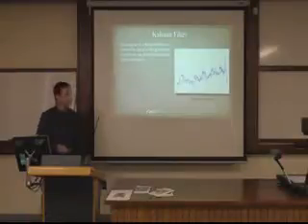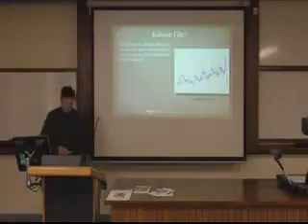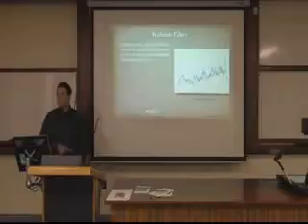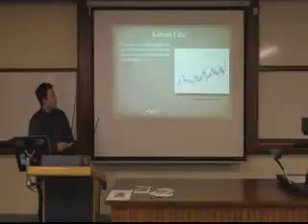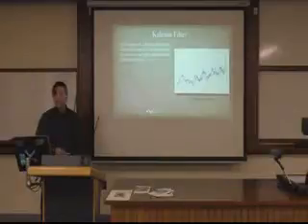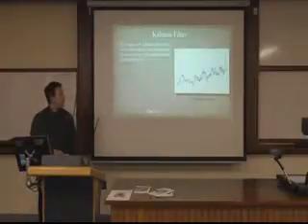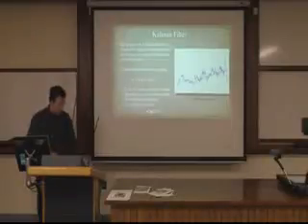And so we have a set of endpoints now with subpixel accuracy, but these are influenced by noise. So the final stage in the process is applying a Kalman filter, and the Kalman filter basically is a method to describe the underlying state of the system when you have noisy data. As you can see here, this blue is a noisy signal, and red describes the underlying state of the system, because my data was noisy, as that's inherently the way you get data from a medical image. Here you can see that it uses the current state of the system and the past state of the system with a noise equation. And so all my results were Kalman filtered.